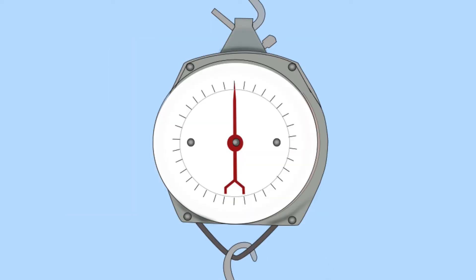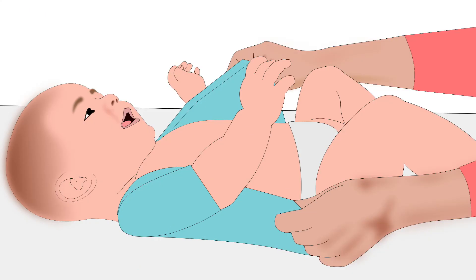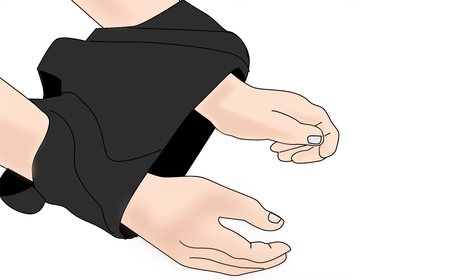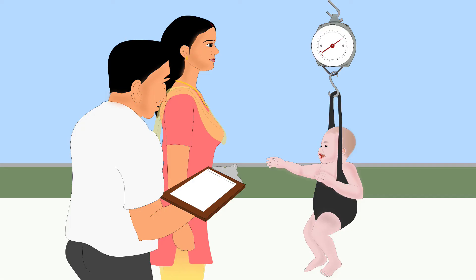Adjust the scale to zero, then remove the pants from the scale. Undress the baby — it is best to weigh the baby without any clothes. Now, put your hands through the open areas of the pants-legs. Gently grasp the baby's feet and put the baby in the pants. Then attach the pants to the scale so that the baby hangs freely.